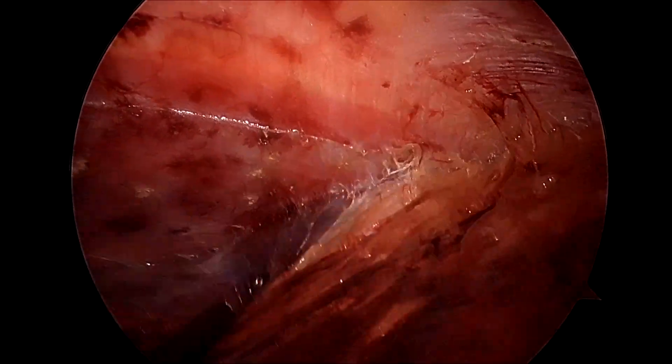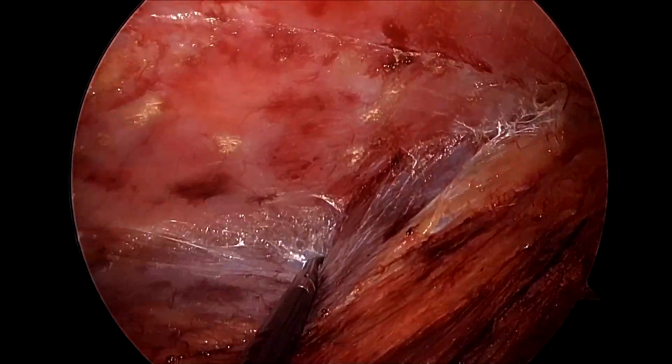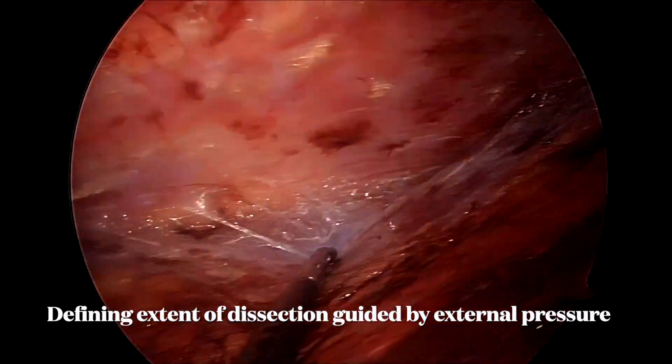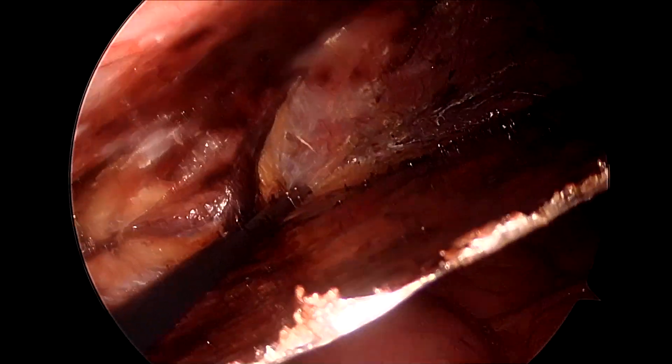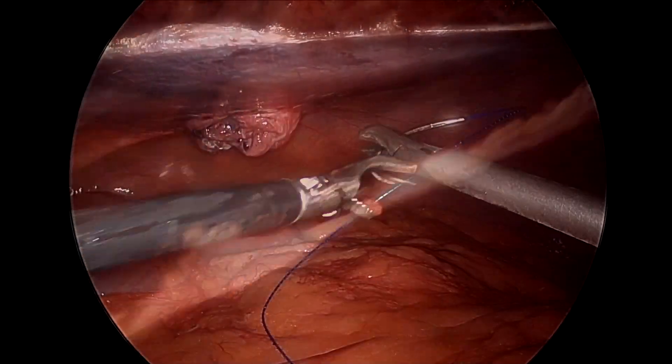Here we have completed our dissection process and are just ensuring that we have made and raised the flap completely, by pressing from the external markings which are all around 7.5 centimeters around the hernia defect.